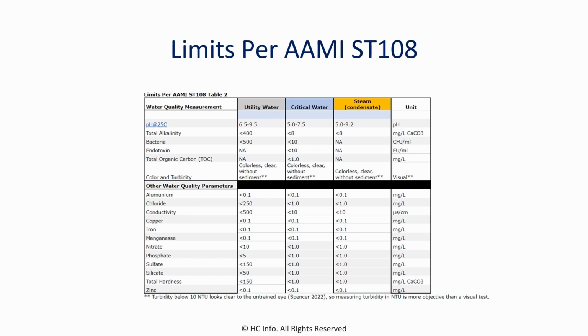The items that you're going to want to test in the field are typically going to be the hardness and the total alkalinity. The reason you want to do that as soon as you can, rather than wait to put it in the bottle and send it out, is there are dissolved gases in a lot of the water, and the alkalinity level can actually change, or you can get precipitation or change from carbonate to CO2. So you sometimes will see differences as those dissolved gases are pulled out of the water over time.